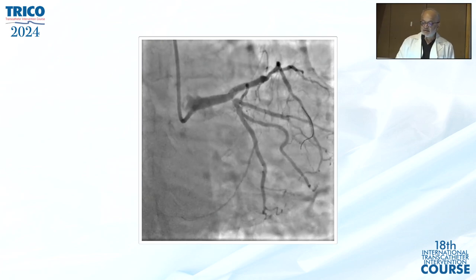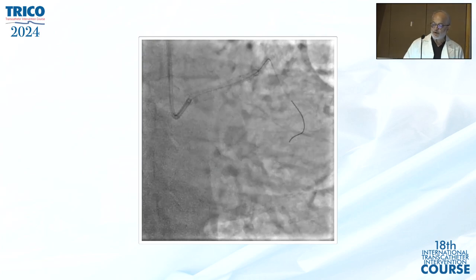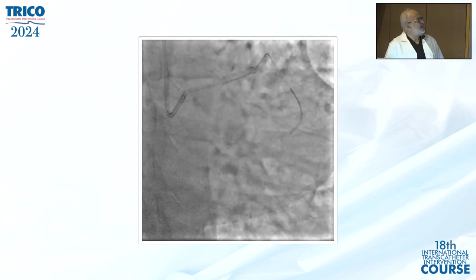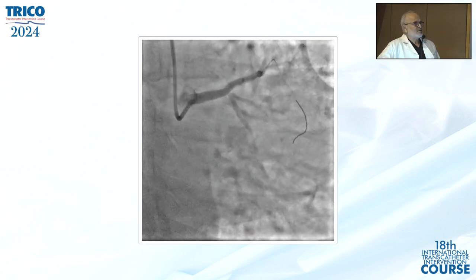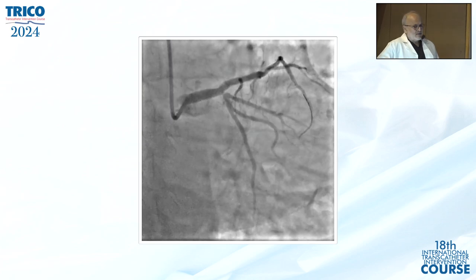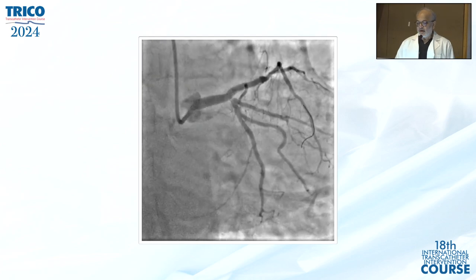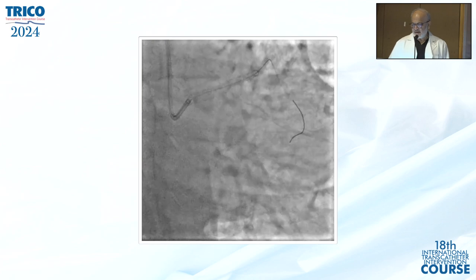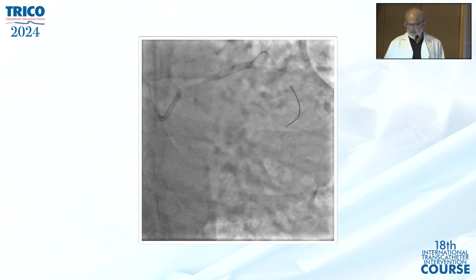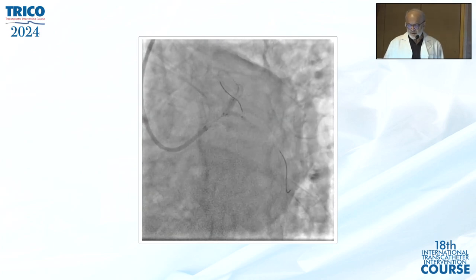Dilated and stented because the circumflex to left main was reasonably good at that point of time, but after stenting, what do you think here at the origin of circ? This plaque shift and very tight. Everybody will think that way. This is plaque shift. I also thought so. And I was almost ready to do kissing balloon and then deploy a stent, sort of T-stenting and then kissing balloon. But then we did a low pressure kissing balloon here.